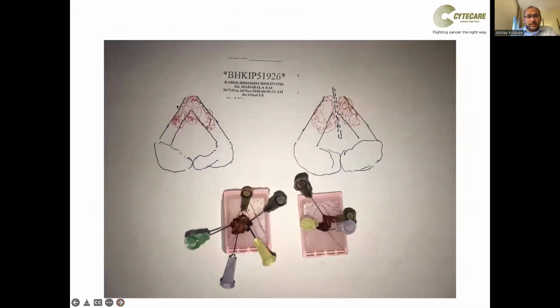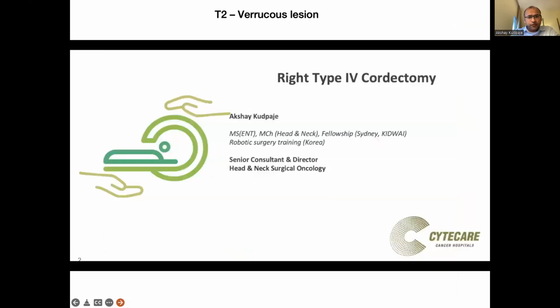So when you do this extensive resection, you do a transtumoral resection, so you break it into two pieces. And then it's very important again to orient it and analyze the tissue properly, and generally these extensive resections need to be followed up with a second look operation.